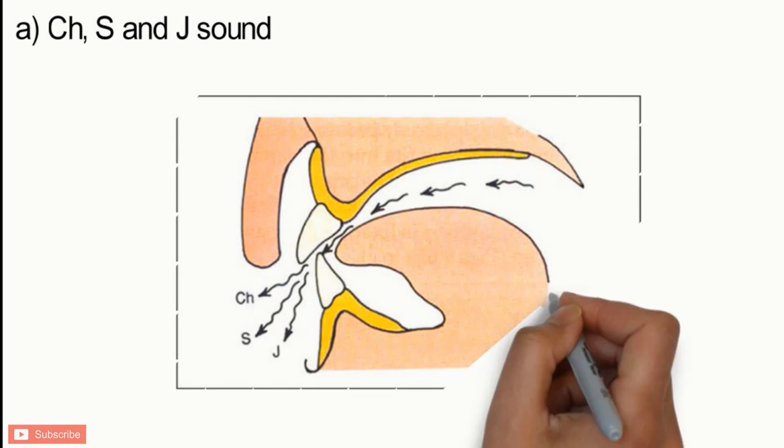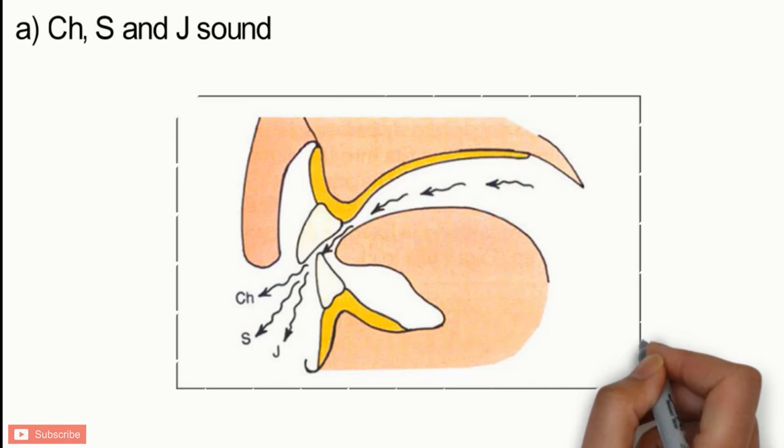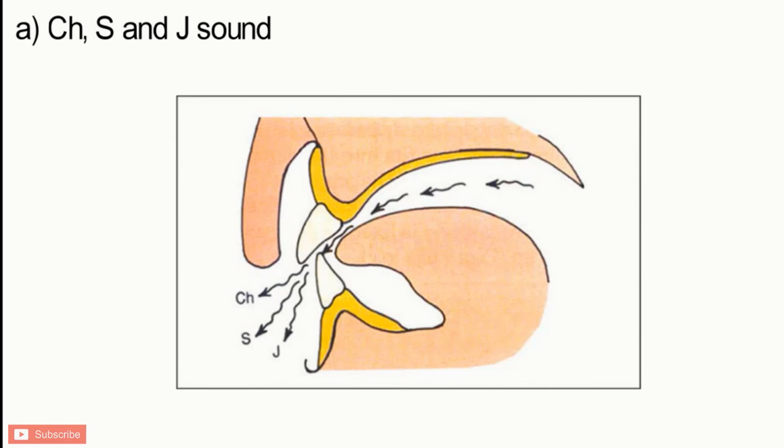For example, the patient is asked to make ch, s and j sounds. Normally, mandibular teeth move forward to a position nearly directly under and almost touching the upper incisors. If the anterior part of the rims touch when these sounds are made, the vertical dimension is too great. The vertical needs to be reduced in this case.